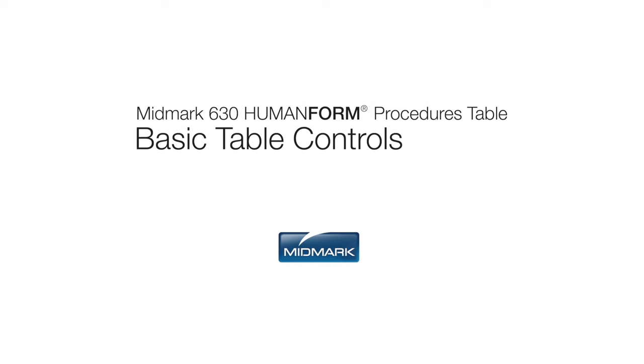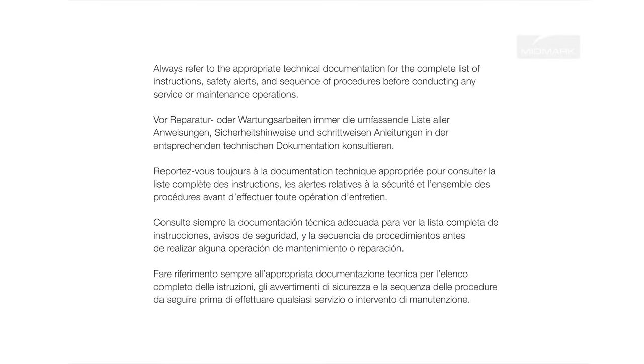This video is an overview of the operation and care of your Midmark 630 Human Form Procedures Table. Always refer to the appropriate technical documentation for the complete list of instructions, safety alerts, and sequence of procedures before conducting any service or maintenance operations.